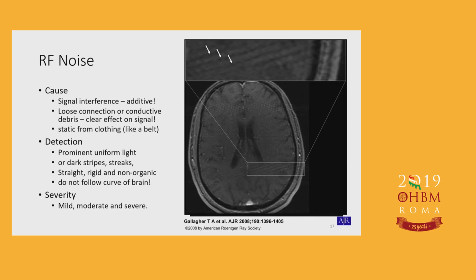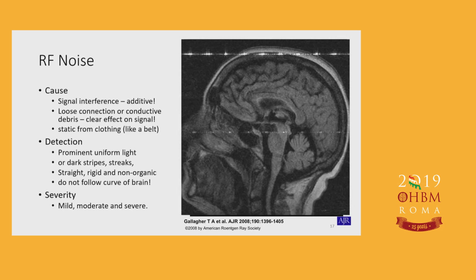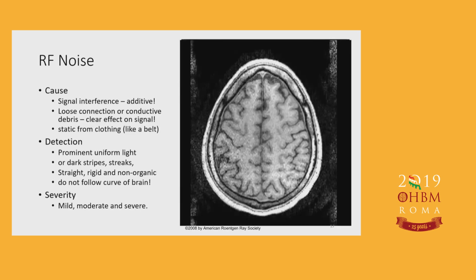Is another really bad artifact. This is the streaks that you might see, right? Usually when you see something like this, it might look localized, but I would think it's just the tip of the iceberg. So you want to look for other signs of issues in the data too. This is another example of lots of noise.